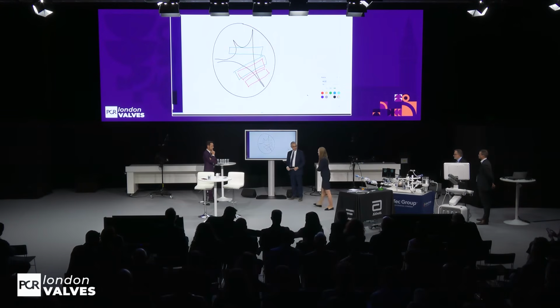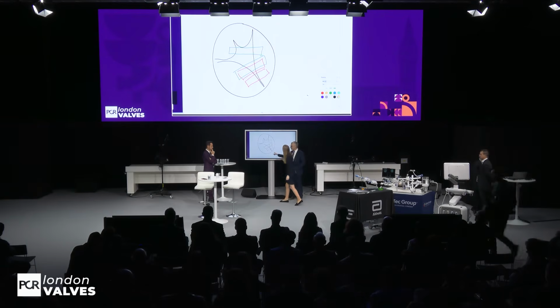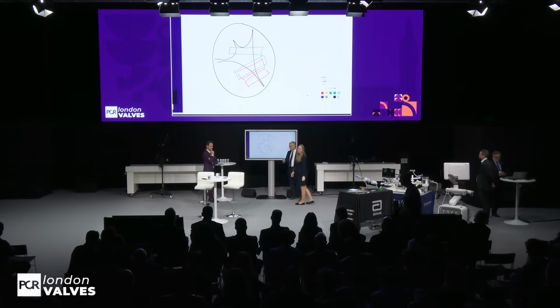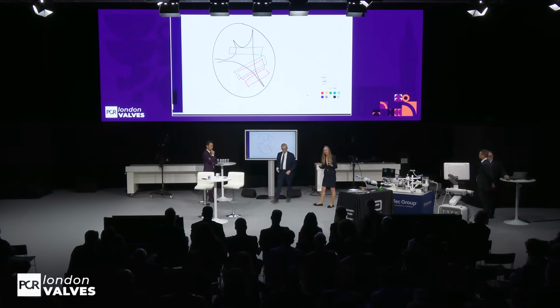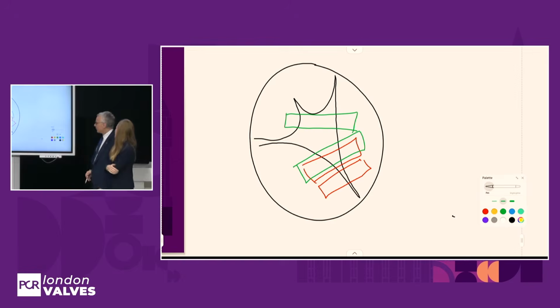To be fairly honest, I don't think there was a lot of jet also in the posterior region. I'm not so sure if we put only 2 devices anteroseptally, whether the posterior region would really be sufficiently reduced. You can say whatever you want, it's only an idea. I would say clover.